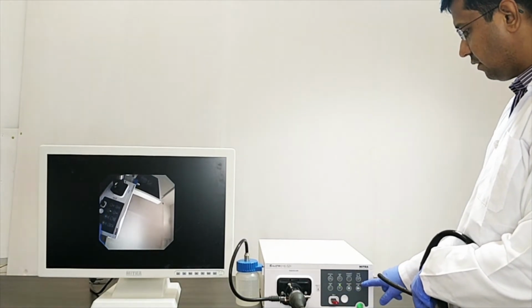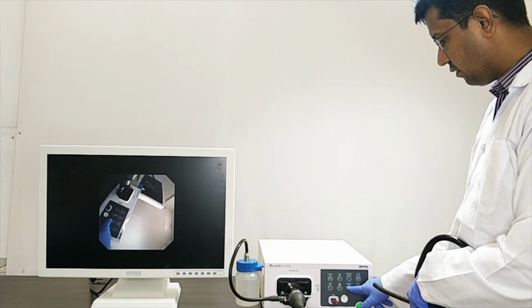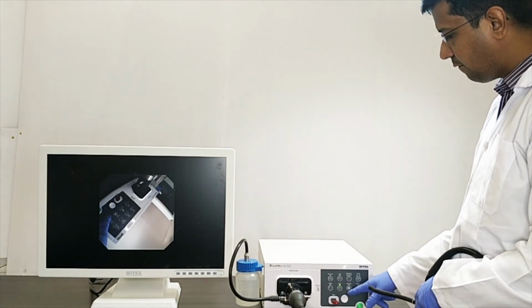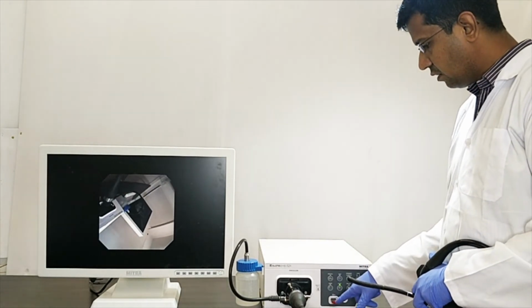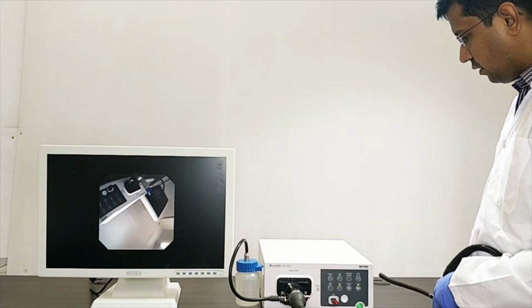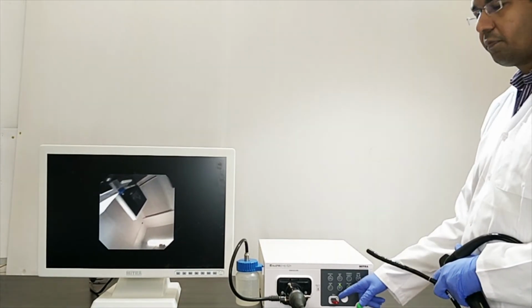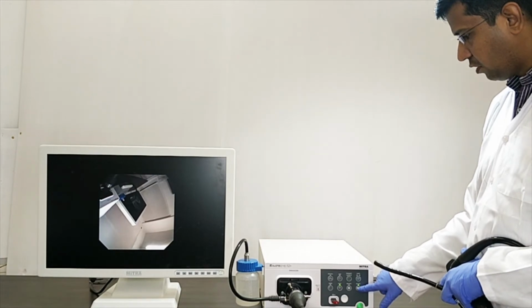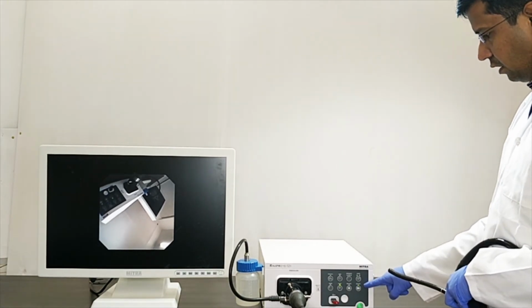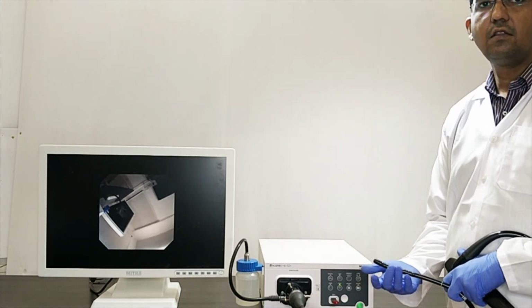Then there is an inbuilt image recording and video recording facility. If I press this image recording button, the light will glow, and once it goes off, that means your image is directly saved in the pen drive. If I press this video recording button, your video recording will start and be directly saved in your pen drive. Now our video recording is completed. We press the video recording button again. Now your LED goes off. That means your recording is saved in your pen drive.